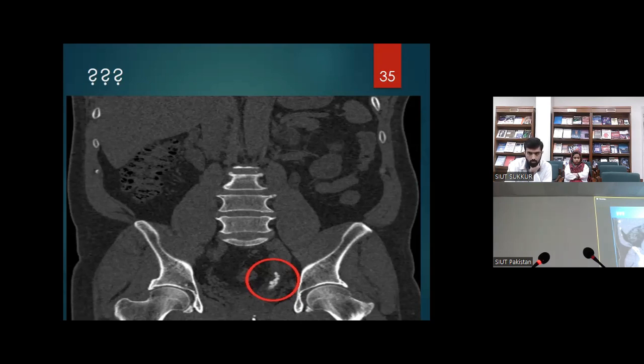There are studies that compared both groups, with high energy and high rate, and low energy and low rate, and their conclusion was that you get smaller fragments with low energy and low rate. So what is your take? Normally the practice is always low energy and low rate. Low rate means not more than 90; 60 to 70 is enough. And we don't know the density of the stones before ESWL, so we can't say whether the stone will fragment totally or partially, or won't be affected. Usually calcium oxalate monohydrate stones are hard, so sometimes they won't be affected in one session.